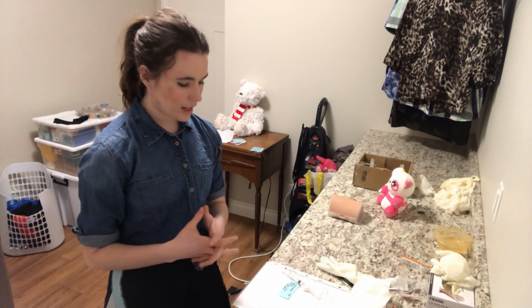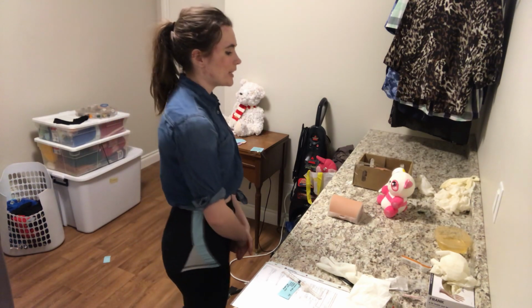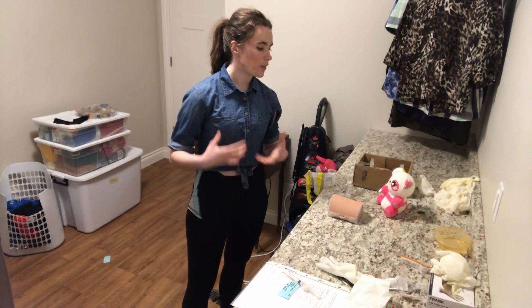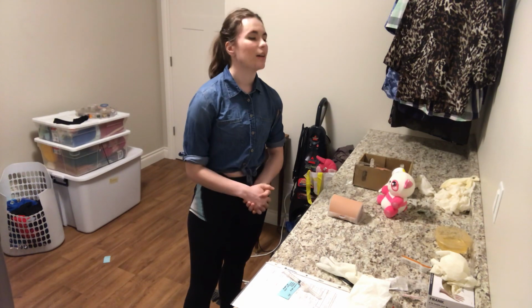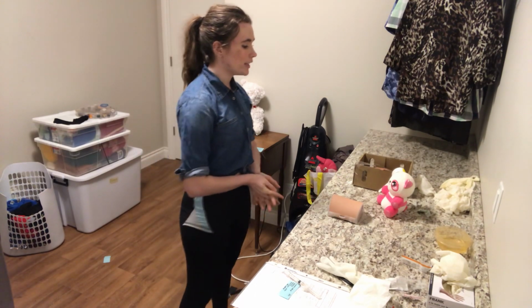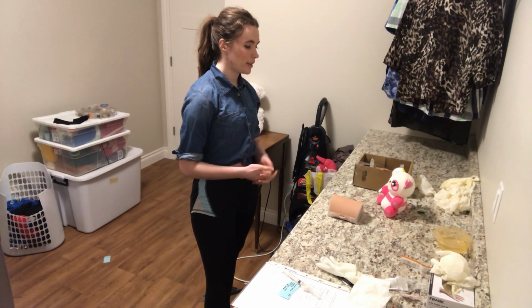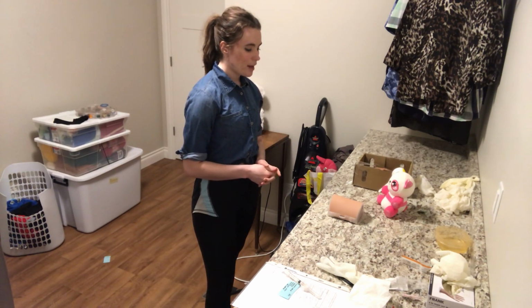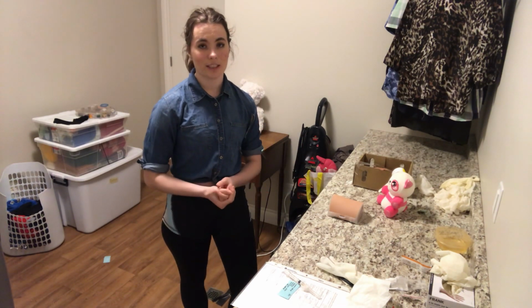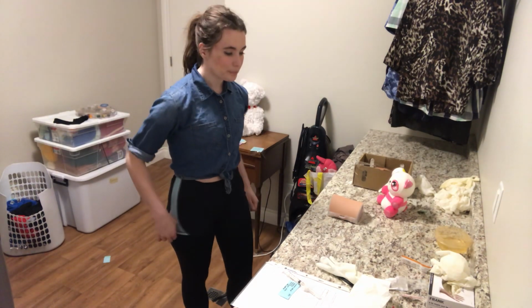So now that I've finished that, I'm going to talk to my patient a bit. So today I'm giving you your heparin injection, and so I'm going to be giving it in your abdomen. So I'm going to go 5 centimeters away from your umbilicus, and I'm going to choose a quadrant that doesn't have a lot of bruising and just find a spot there. So heparin is an anticoagulant, so it's used to kind of prevent the formation of clotting. Just because you have decreased mobility these days, we want to prevent the formation of clots that could complicate your condition. And so I already checked with the physician. Generally, we like to avoid giving heparin to people that are over 50, 60 years of age, and you are 61, but I double checked with the physician, and we do have a good reason for giving it in this case. So that's good.